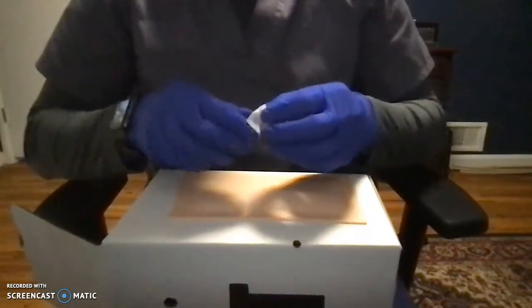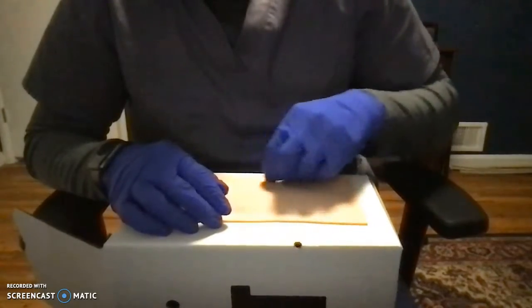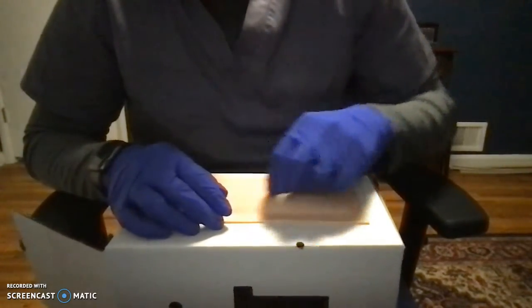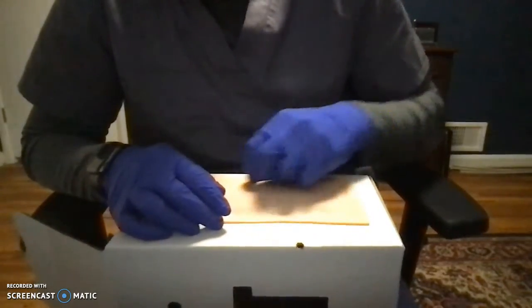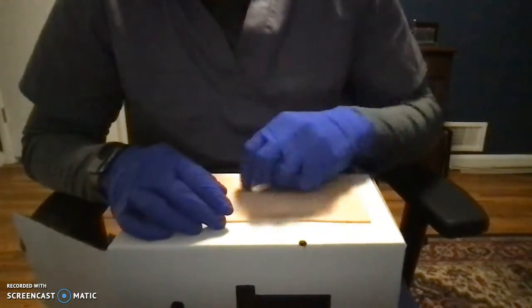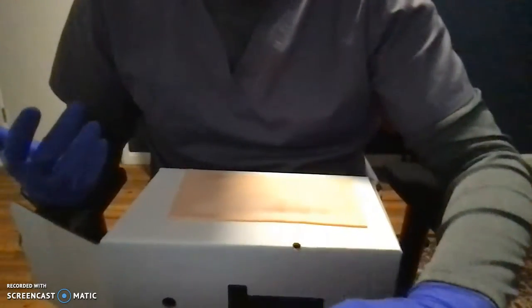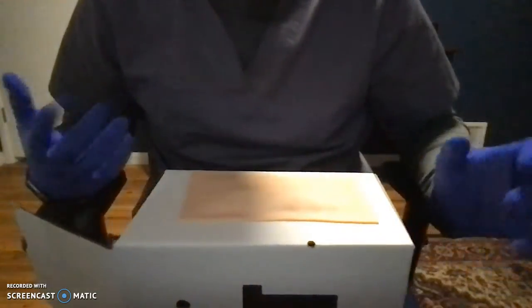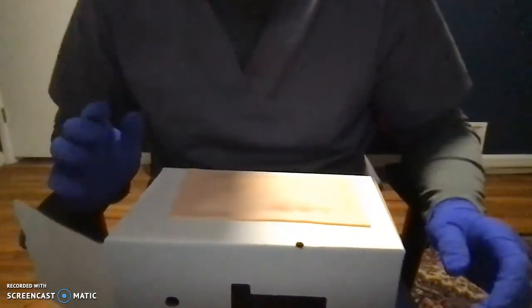So we're going to go ahead and clean this out. When you're doing it with an alcohol swab, you want to start in the center, and then you want to go ahead and go out in about a 2-inch diameter. Make sure that it's nice and clean in a circular motion. Once it's clean, go ahead and get rid of the alcohol swab, and then you're not going to want to touch it, of course, or blow on it or wave it or anything like that. You want it to dry on its own.